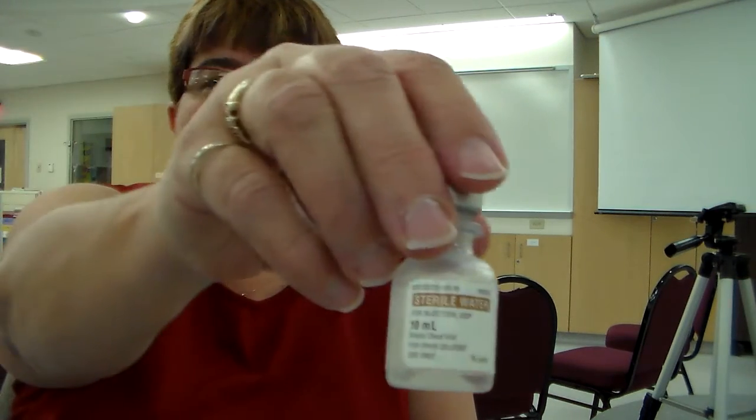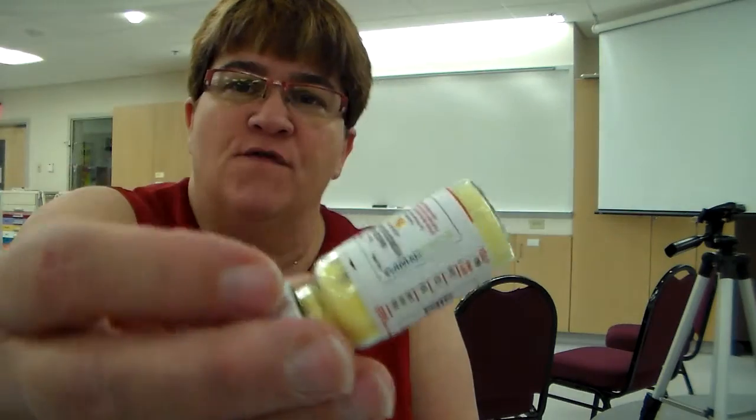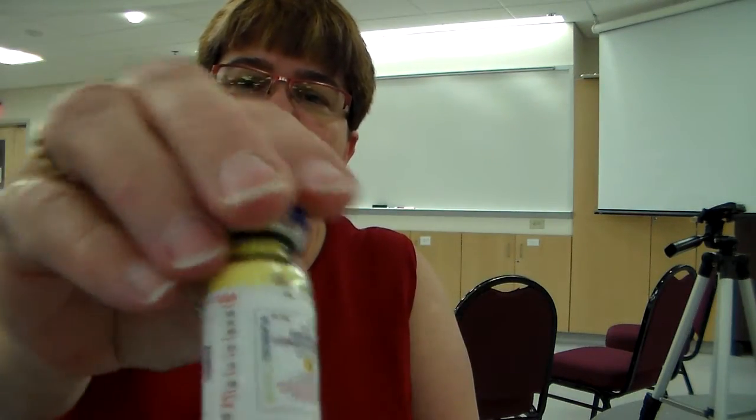All right, so this is skill 2.22, preparing medications from vials. Vials look like this. They can be glass, they can be plastic, and they can be any medication. They can also be in powder format, which you have to add liquid to in order to extract the medication.